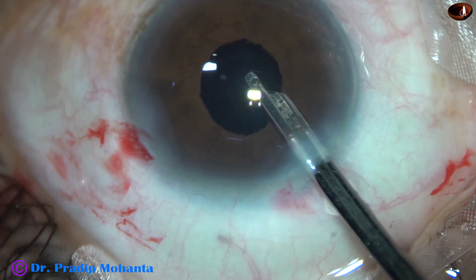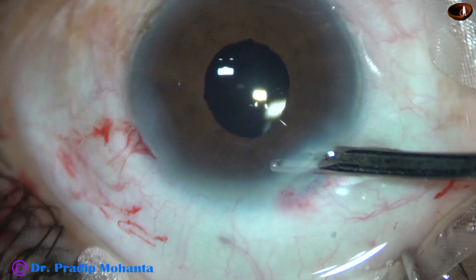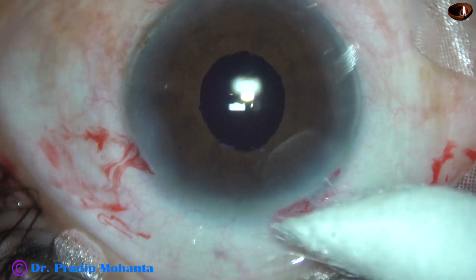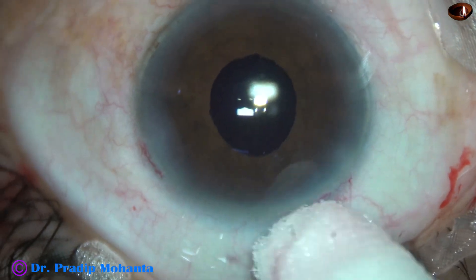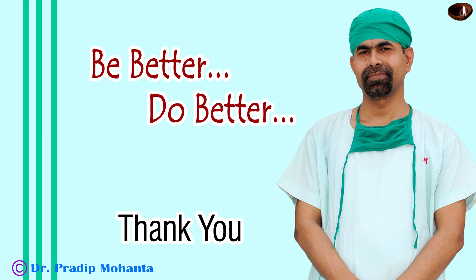The pupil is almost round. The Seidel test is formed very nicely, and the integrity of all the wounds are checked. The case is concluded. A few drops of moxifloxacin is applied over the ocular surface. Thank you very much for your attention. Hope this video will help you in developing your surgical skills, encourage you to use a pupil expansion device in cases with hard cataract with small pupil, and give you some tips to do sub-Tenon's block in such cases.